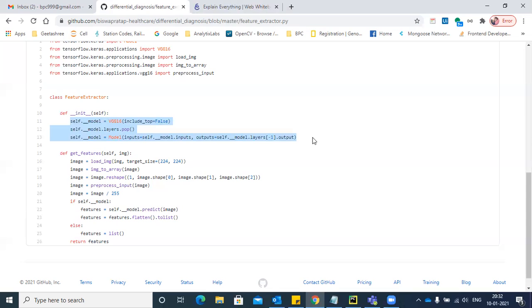The new thing is that instead of human beings sitting in front of the x-ray and analyzing it and generating reports, I can use an AI agent who can in parallel generate and analyze a lot of reports very fast. So this is the novelty and the benefit of this project.